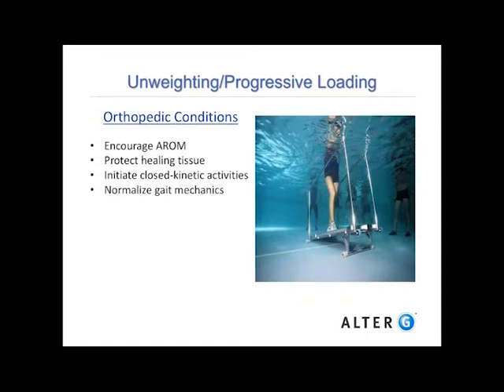The goal to get someone in weight bearing is, of course, you want to normalize their gait mechanics. You don't want them compensating for too long. You want them getting back to walking with full extension, with full weight shifting, with proper loading. And so the sooner we can do this, the better results we see. And then for athletes or people that want to train, they've got to maintain aerobic conditioning.